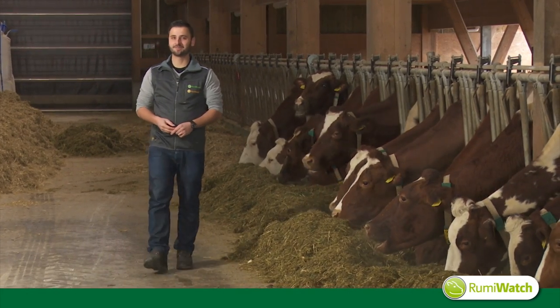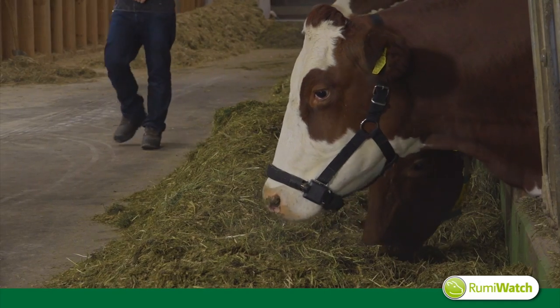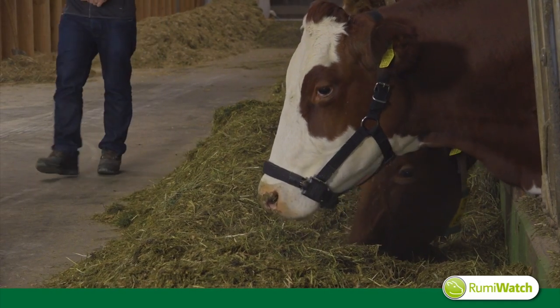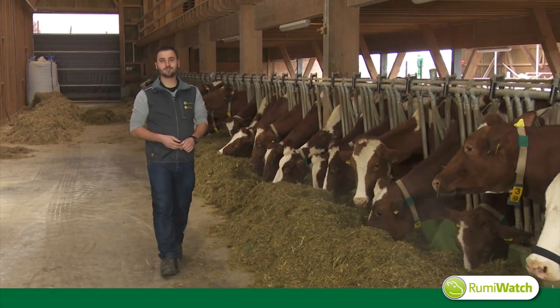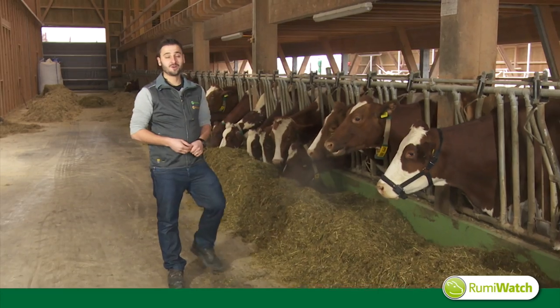Welcome, my name is Christian. I'd like to present you the RumiWatch system, an animal monitoring system for scientists. Today we will see the application of RumiWatch for intake estimation and posture. So let's start the measurement.